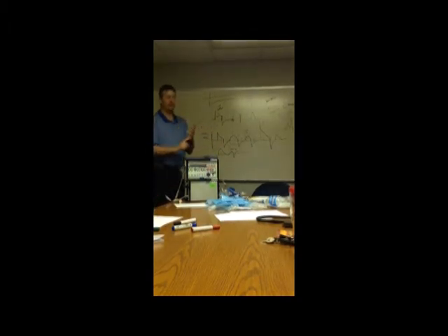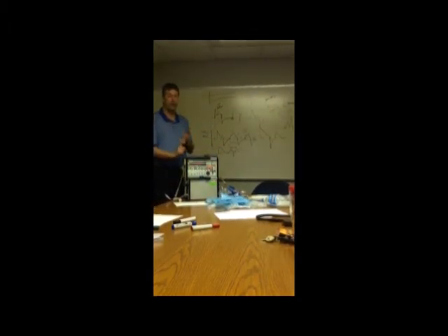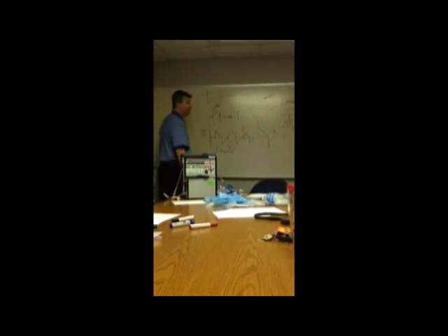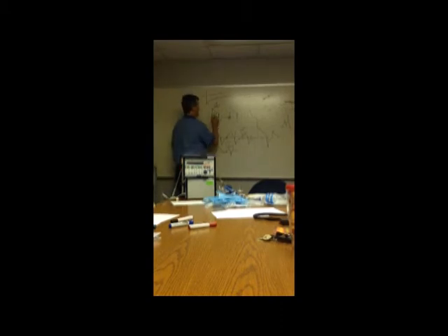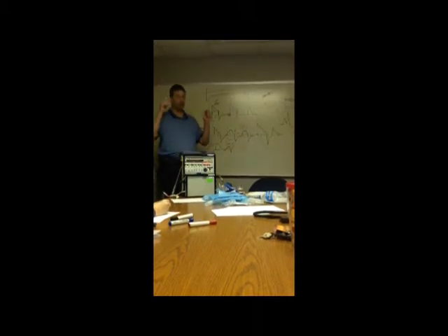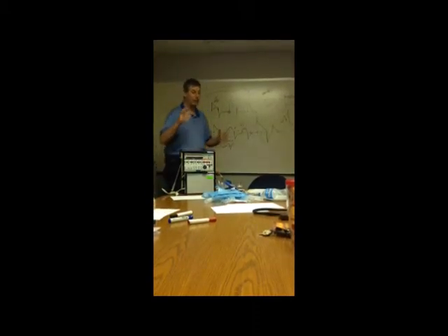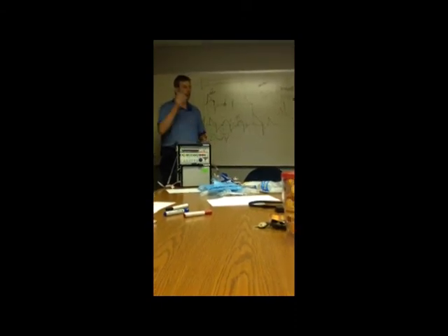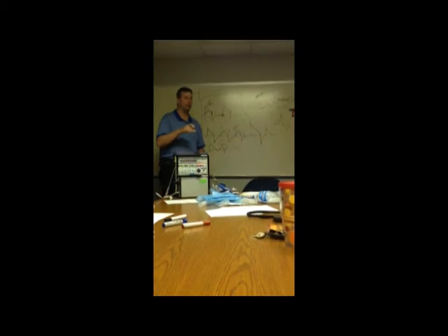We use assist control pressure control, assist control volume control. Both of those are this mode. We use SIMV pressure, SIMV volume. That's 2 different versions of this one. And then we use CPAP PSV, that's the only version of that. So, what makes the 2 versions of this different is the breath type, is how it blows the air in, okay?